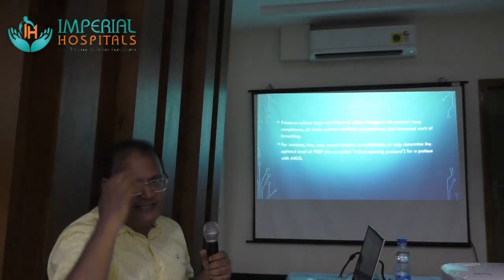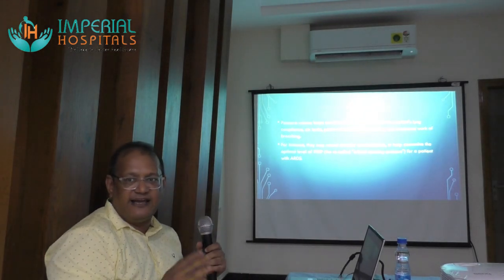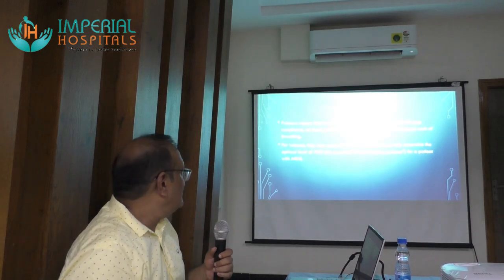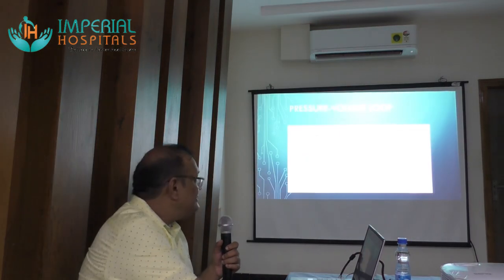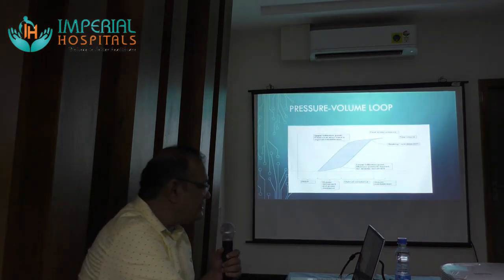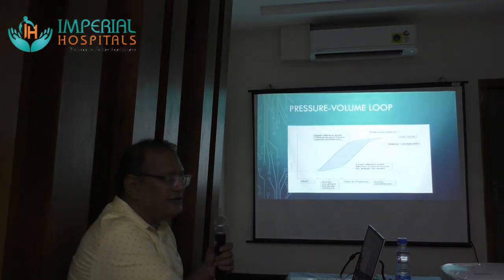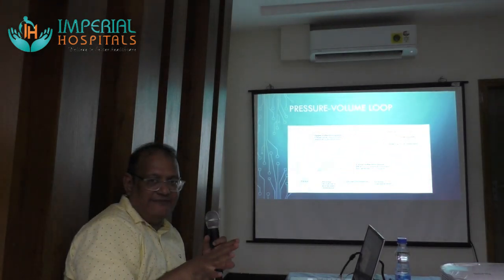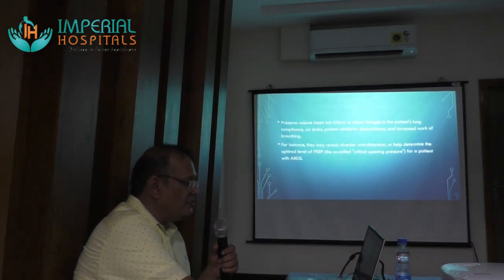So for the scalars, we were graphing them against time, right? Where time was on the x-axis and the y-axis could be either pressure, flow, or volume. Now, if you graph these against one another, like pressure against volume, you'll get a looping pattern on the ventilator graph. So first we'll be looking at the pressure volume loops.